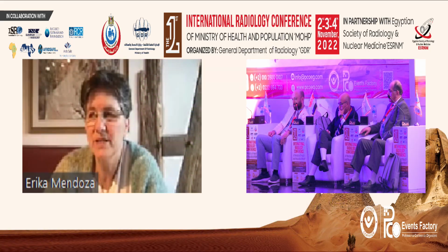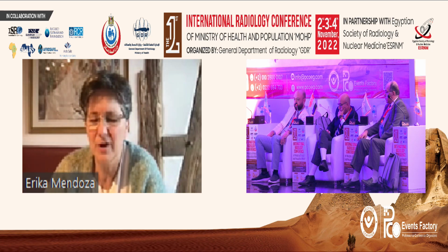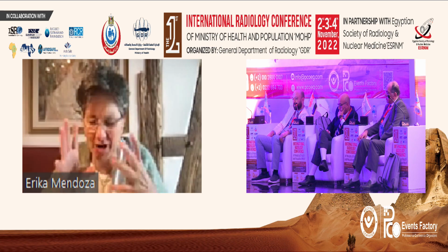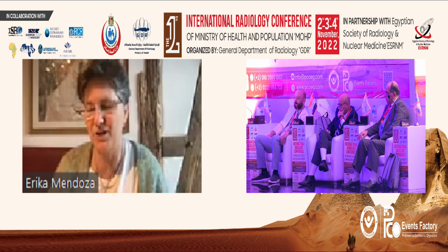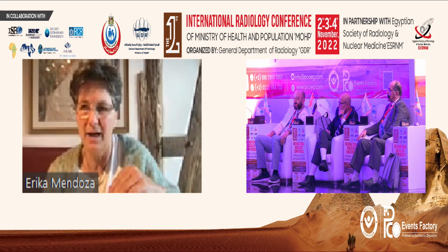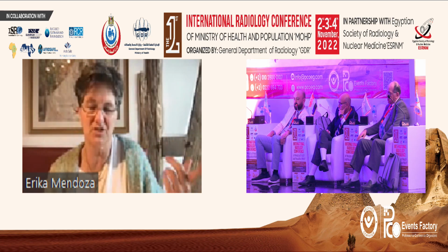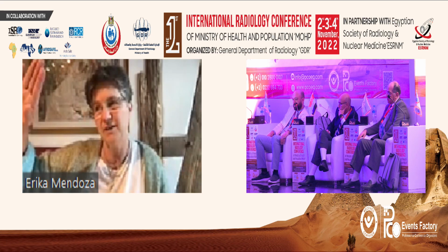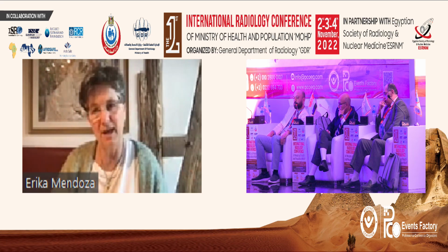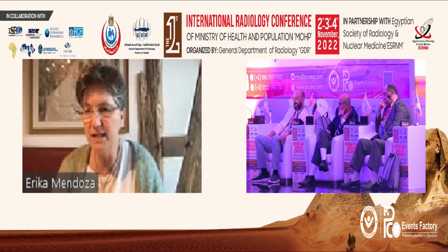No, I don't do this because in Germany we had some cases of doctors misusing patients, and this is strange when you start doing genital explorations because of the history we had in the last 20 years. Besides, I think this is only necessary in patients with a pelvic congestion syndrome. Of course, if I see the veins coming down the labia, I ask, do you have pain in sexual intercourse? Do you have pain when you have your bleeding and so on?